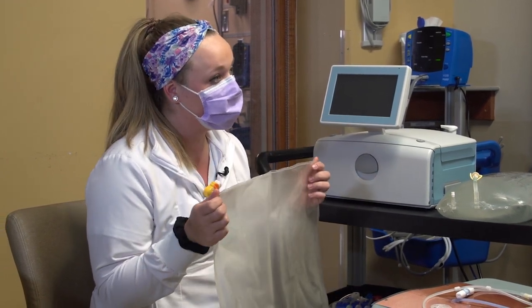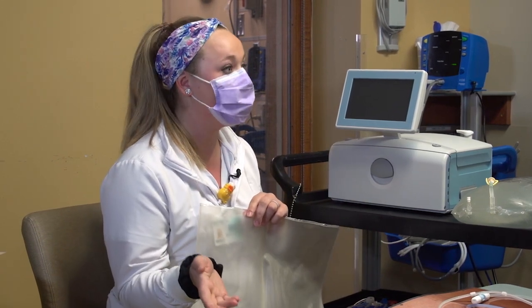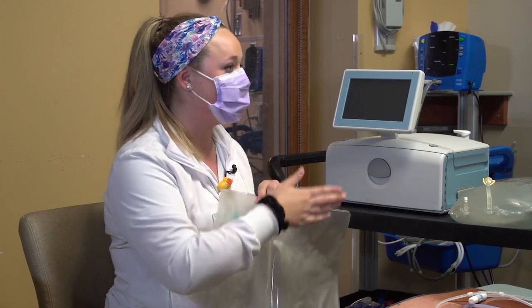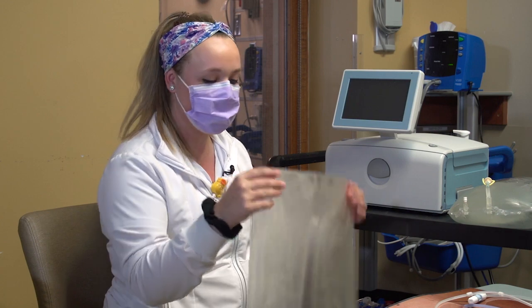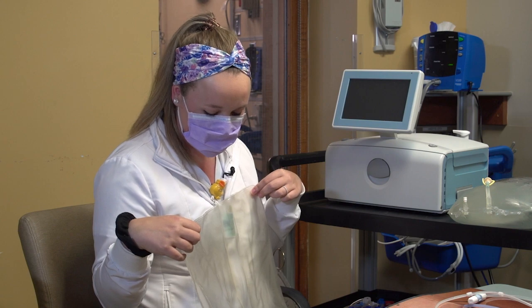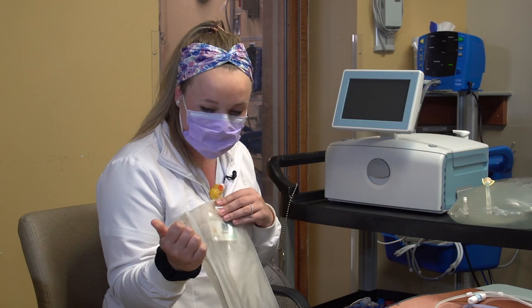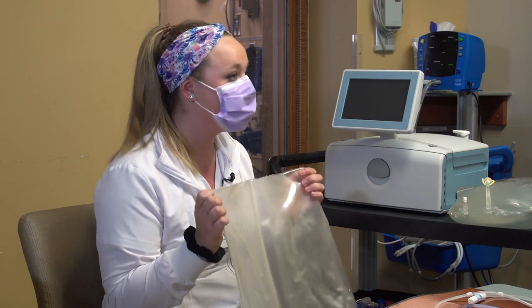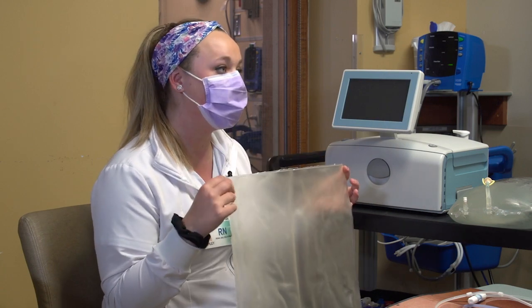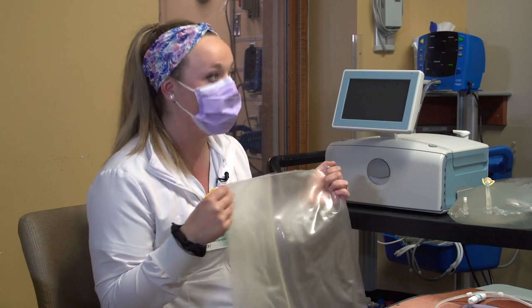Now, you have two options on peritoneal dialysis. You have the option to either drain into the toilet at your home if you have enough space or length from where you're going to be dialyzing to where your toilet is. Otherwise, you have the other option of using a drain bag. And this typically holds up to 15 liters. But each package comes with two. So depending on your dialysis prescription, you may use two, you may use one. The only downfall with the drain bags is that they do get quite heavy when you're trying to drain them back into the toilet after your treatment.